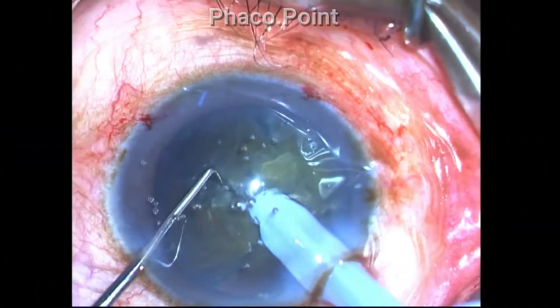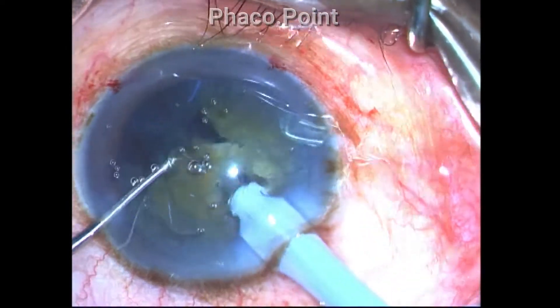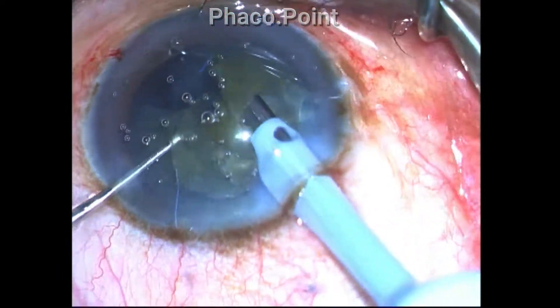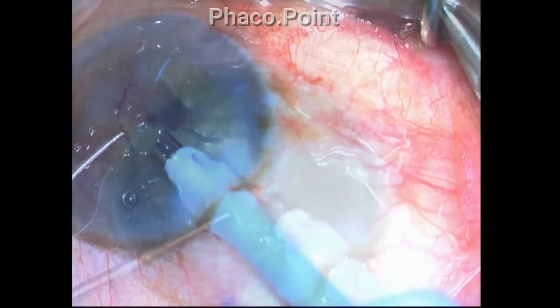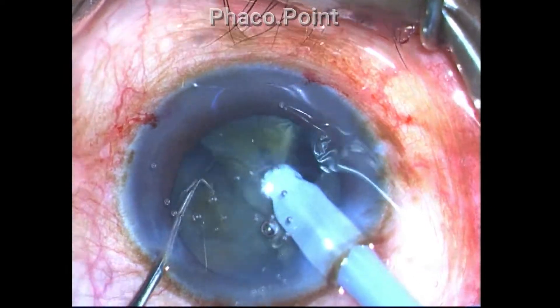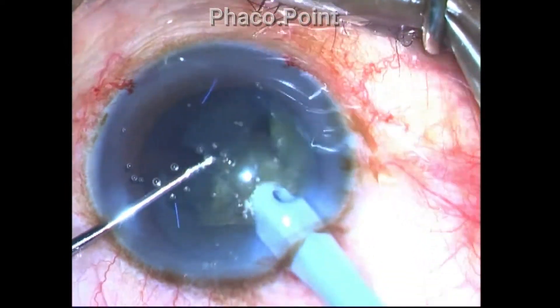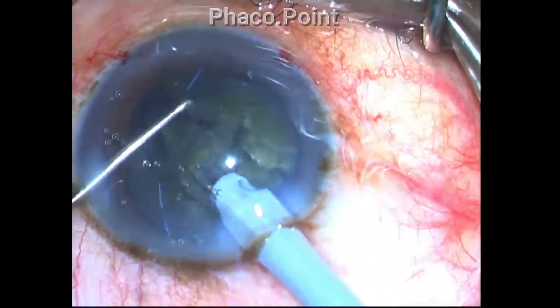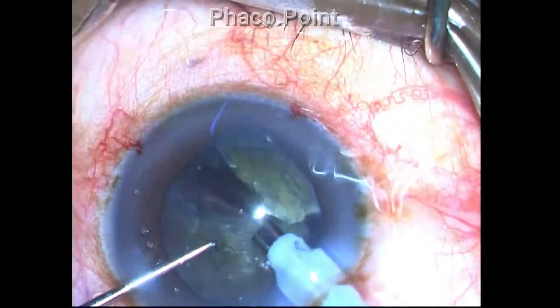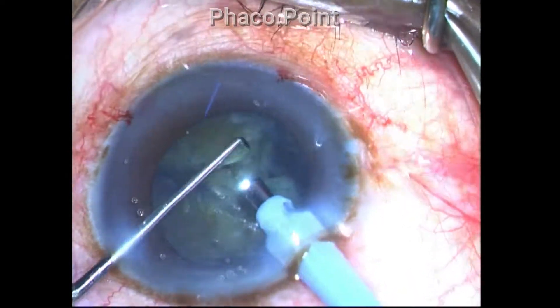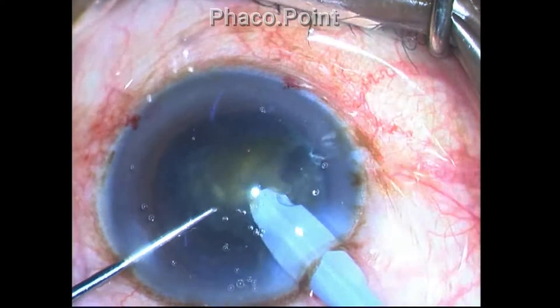In this case of a grade 3 nuclear sclerotic cataract, I have come to the stage of fragment removal and have already cracked the pieces. You can see that while I'm attempting to remove one fragment, there are already smaller pieces floating around in the anterior chamber. Note that the piece I am mobilizing into the anterior chamber is quite large, and as I downsize it, it causes the release of multiple small fragments. These fragments are carried by the aspiration flow rate, circulate in the anterior chamber, hit and knock against the corneal endothelium, and can produce mechanical damage.